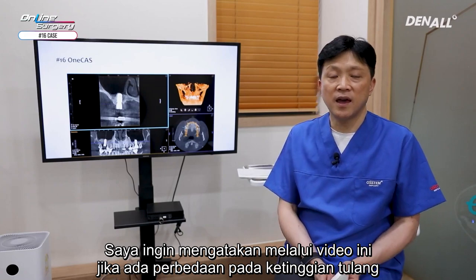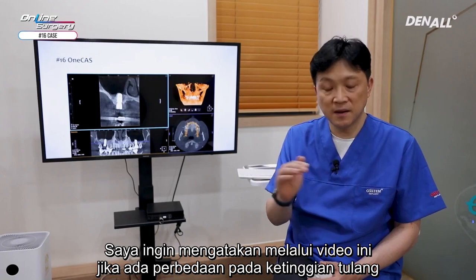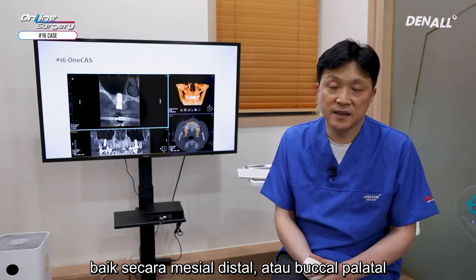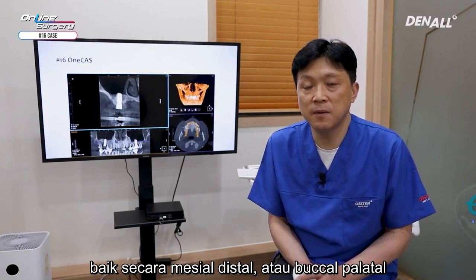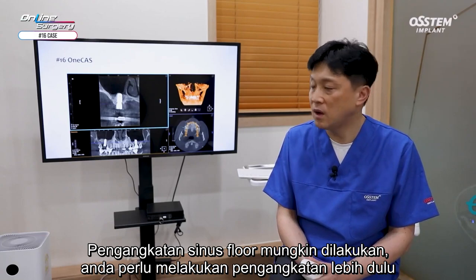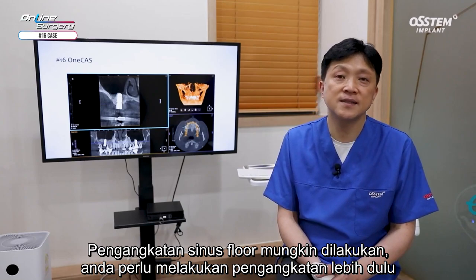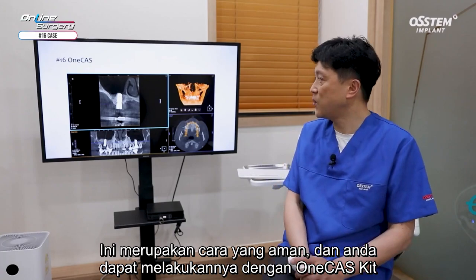What I want to say through this surgical clip is that if there's a difference in bone level, mesiodistally or buccally or palatally, you need to start with the short side first. Even with a partial perforation, sinus floor elevation is possible. You need to do elevation first and then do full depth drilling. This is the safer way to proceed.